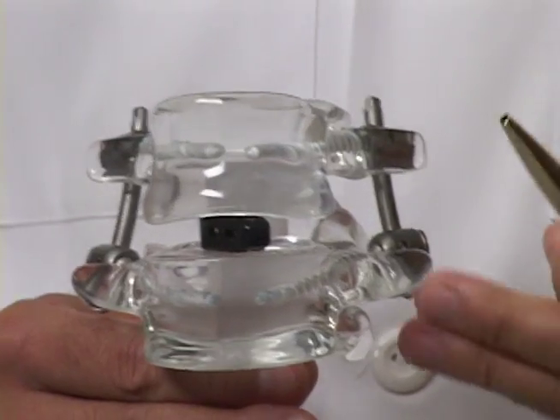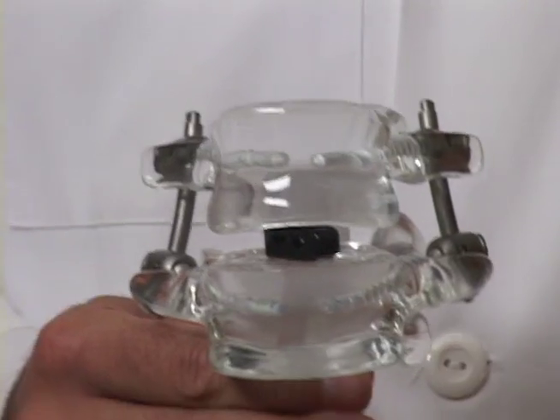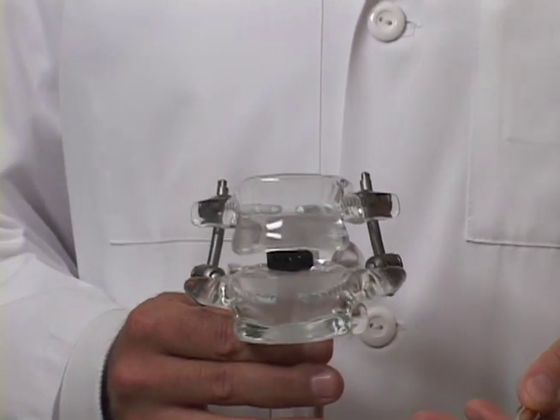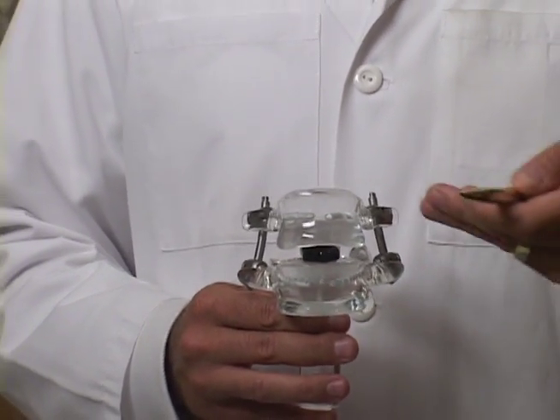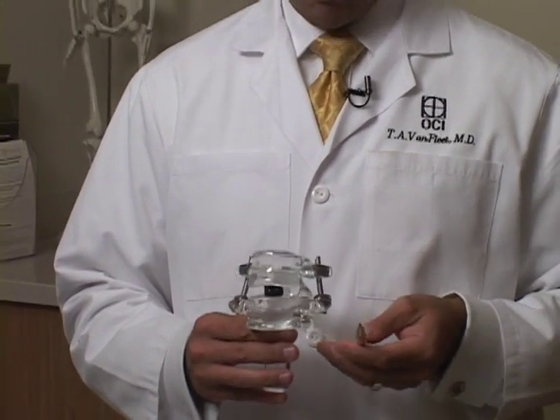In this particular situation, my current preference is to use bone morphogenic protein, which the FDA considers an off-label usage — it was only approved for insertion from the front of the spine, but we use it here in an off-label application.